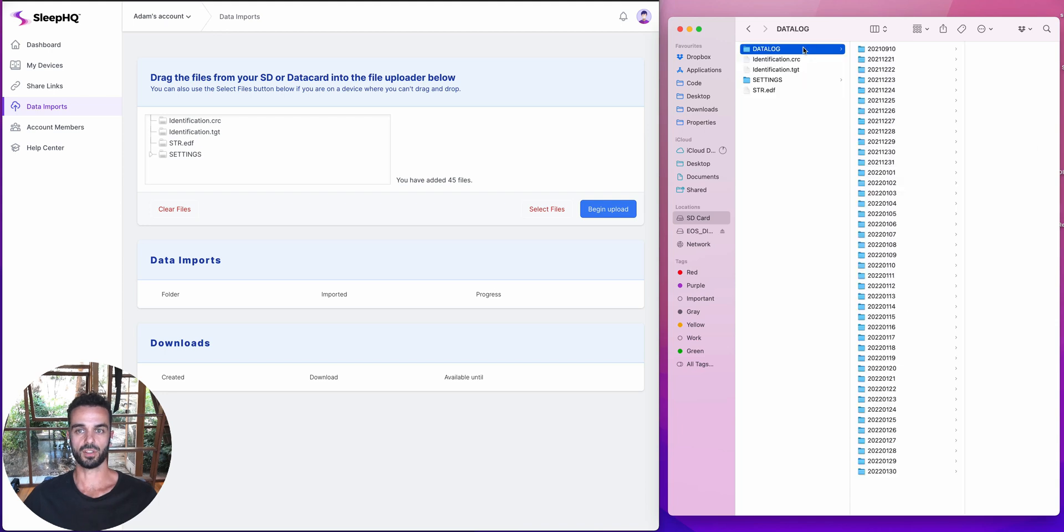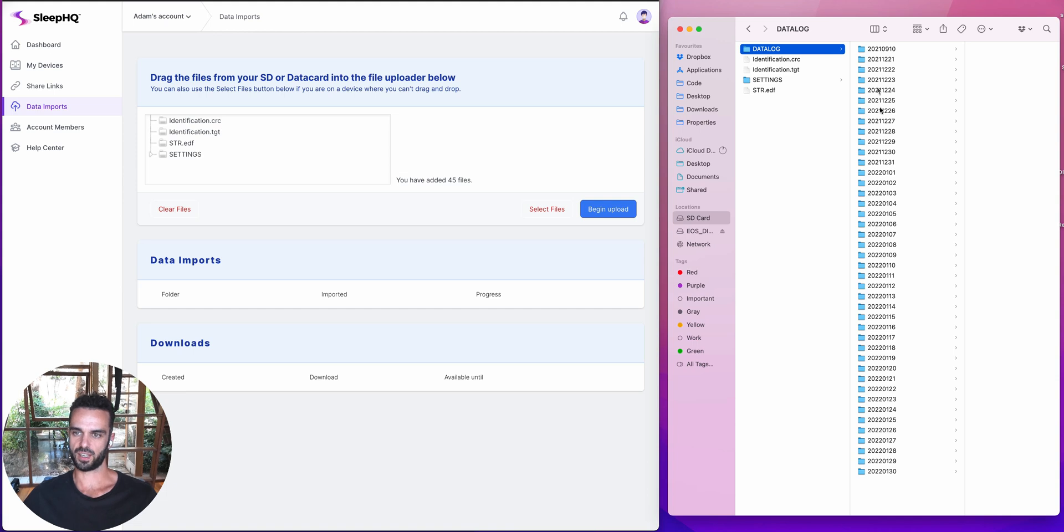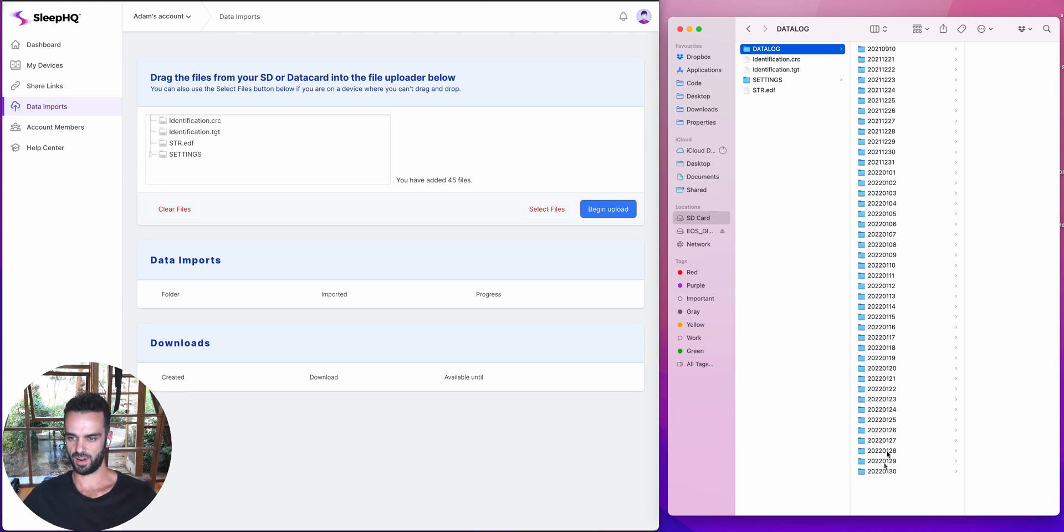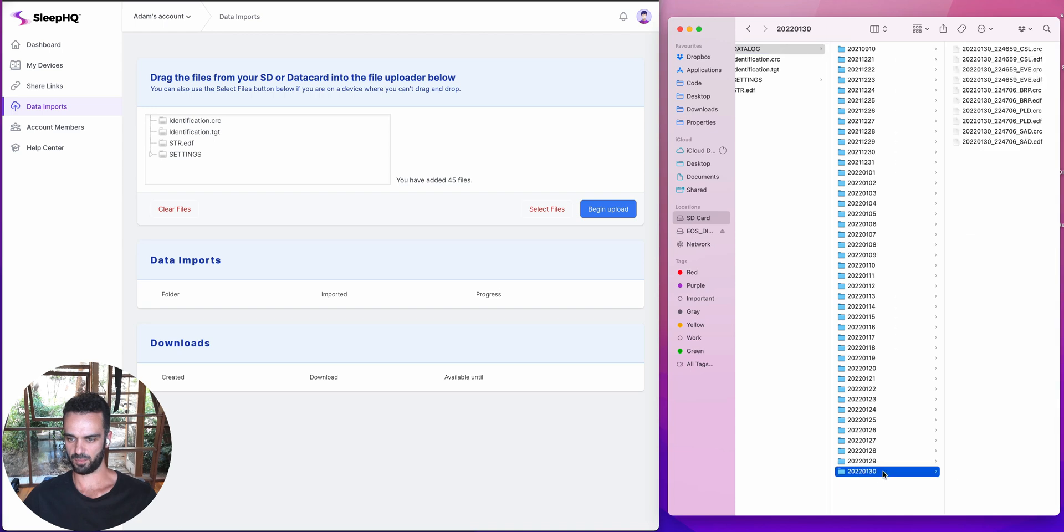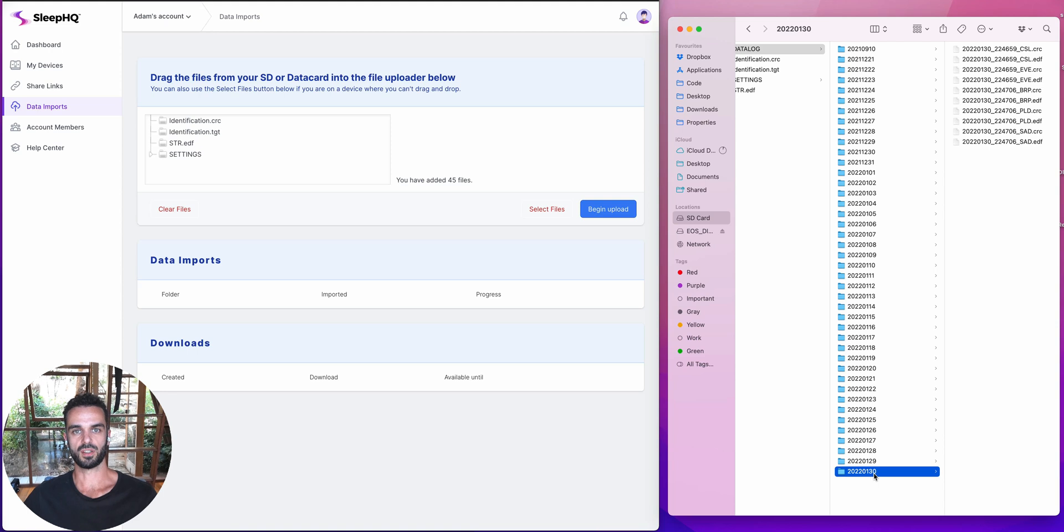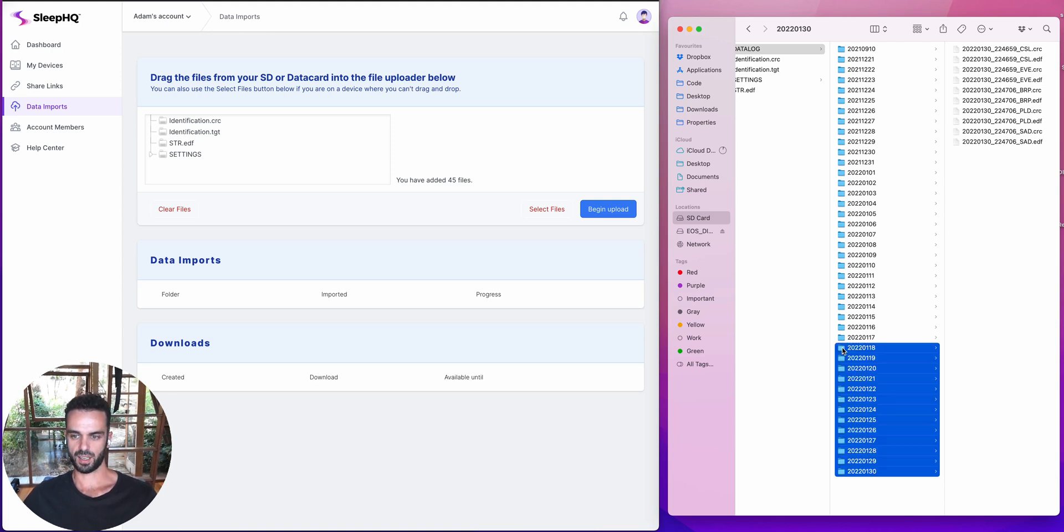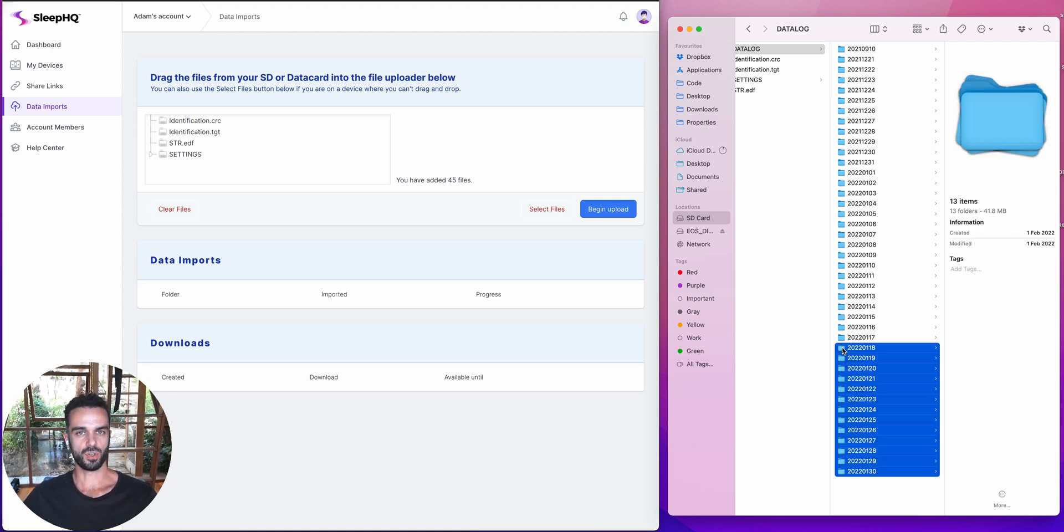Now, what I'm going to do is I'm going to go to the data log folder and I'm going to drag in just a few of the files that are in here. So you can see all of these folders are timestamped. These are all dates. So if you have a look at this last one down the bottom here, we've got 2022 01 30. So that's my data from the 30th of January, 2022. And I can select as many or as few of these folders I want to drag in.